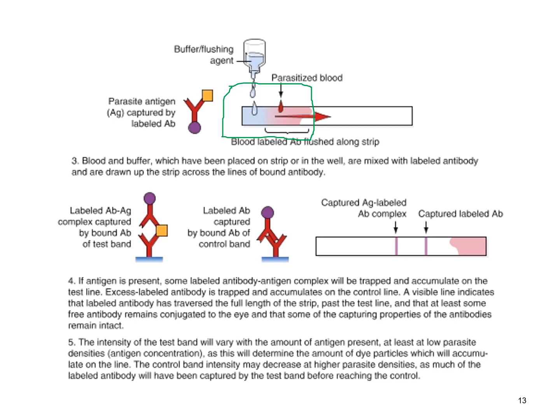It's going to allow those labeled antibodies that are present in the sample well down here to attach to that antigen that we just broke off, or that we're breaking off in this process. So that's going to allow those to attach to this labeled antibody. And so you can see that it's actually labeled with something that we can visually see. It's got that little purplish dot there.